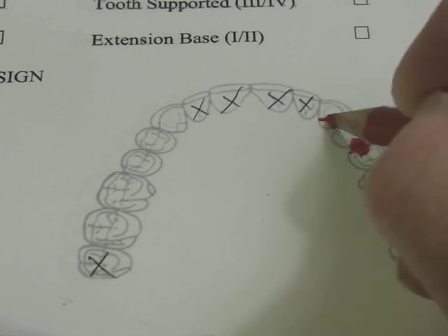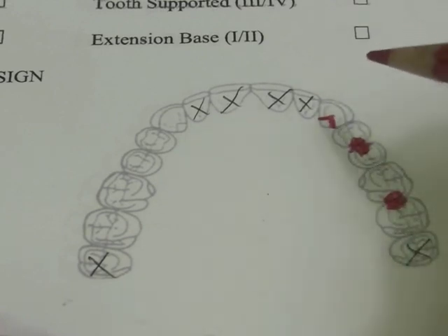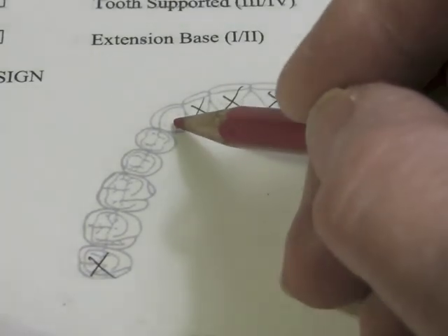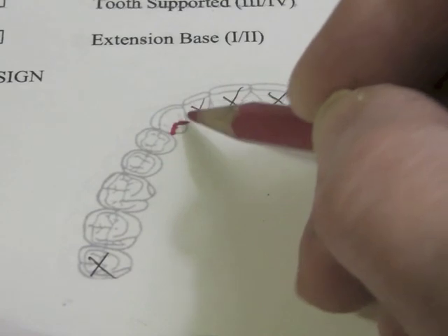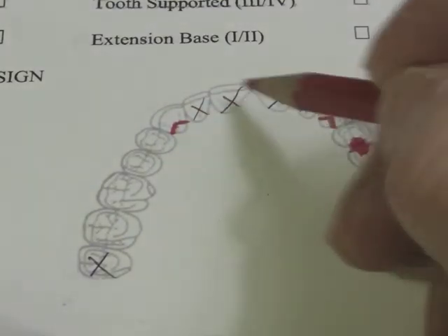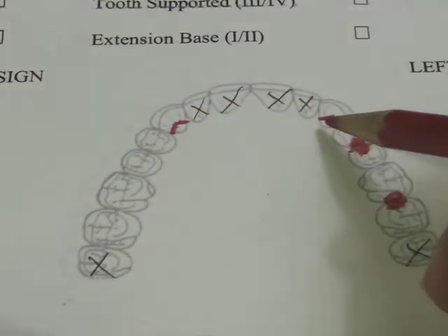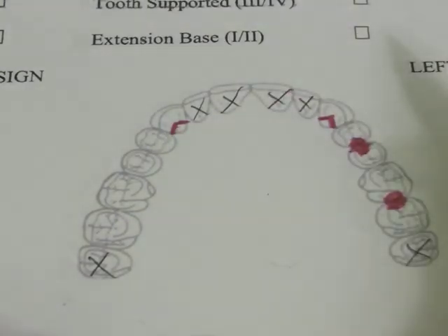So on the maxillary arch, the canines are quite prominent on the cingulum area and we can actually cut a cingulum rest. So we have to have support next to or near this edentulous area. So we will have rest on our canines.